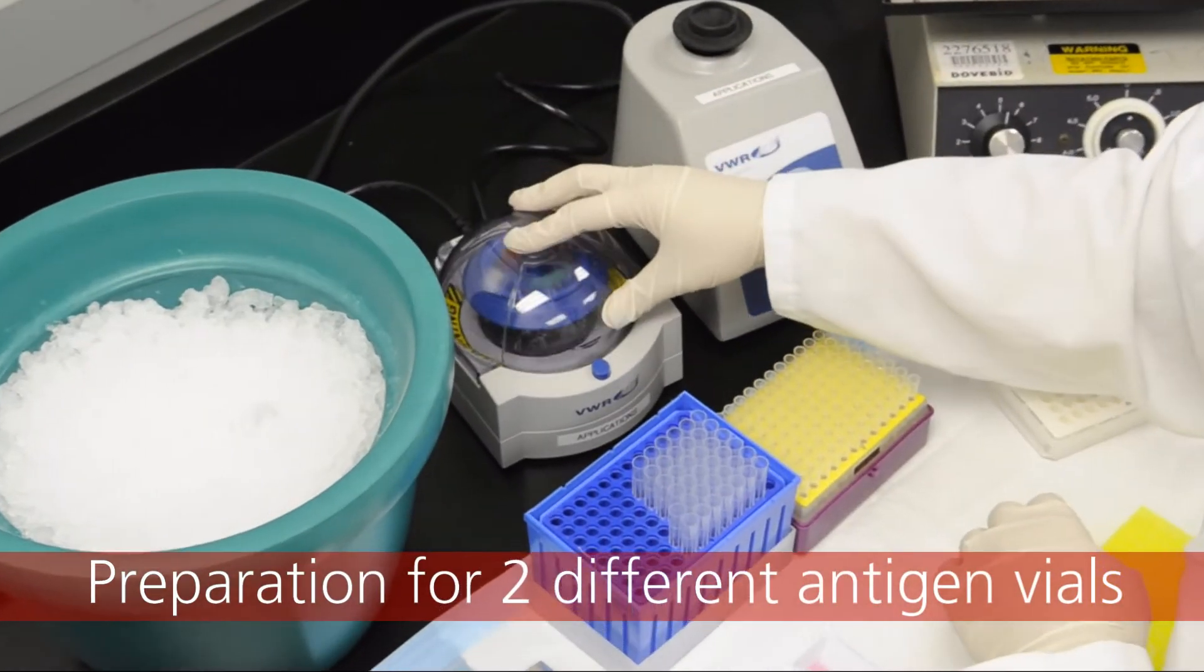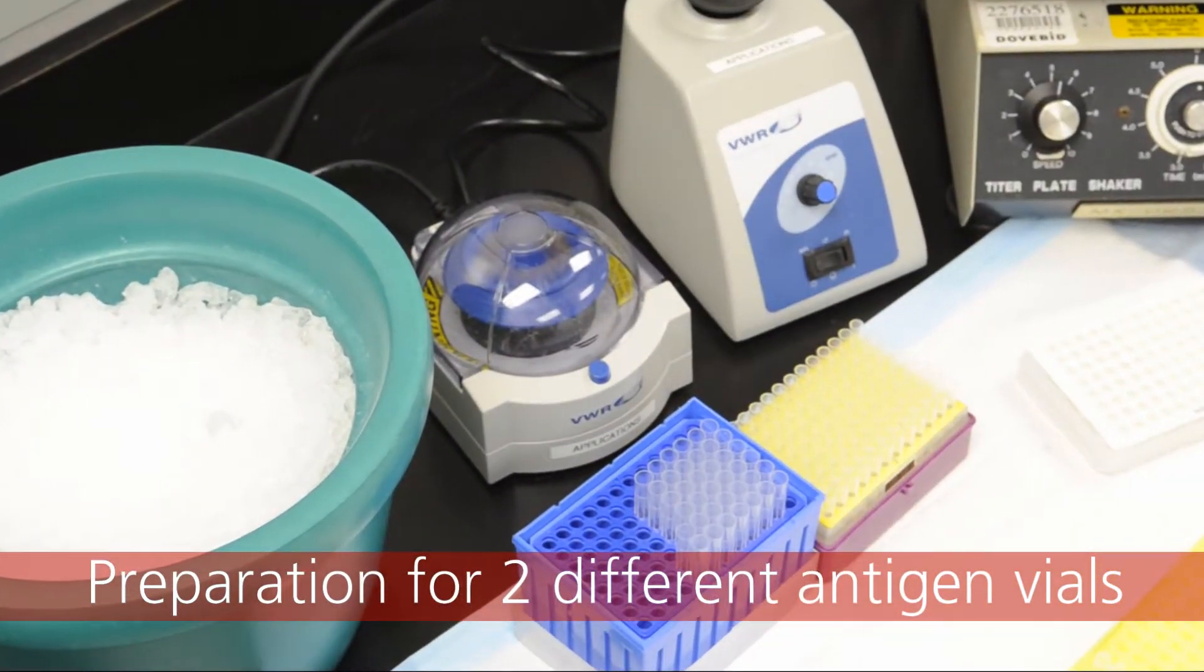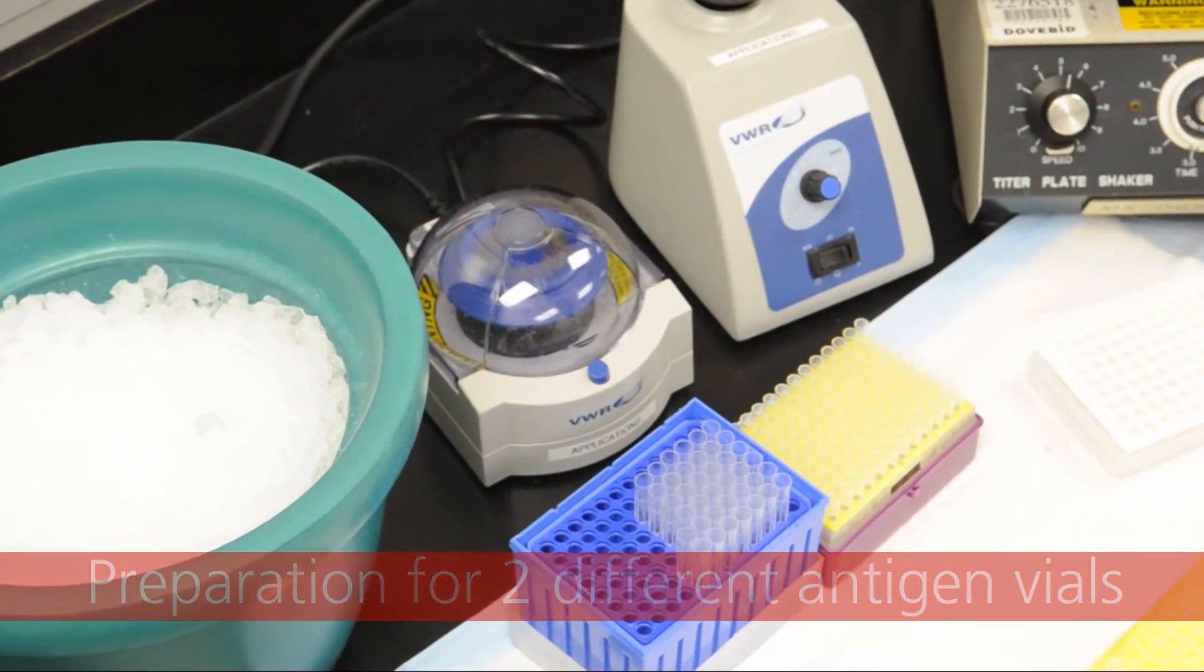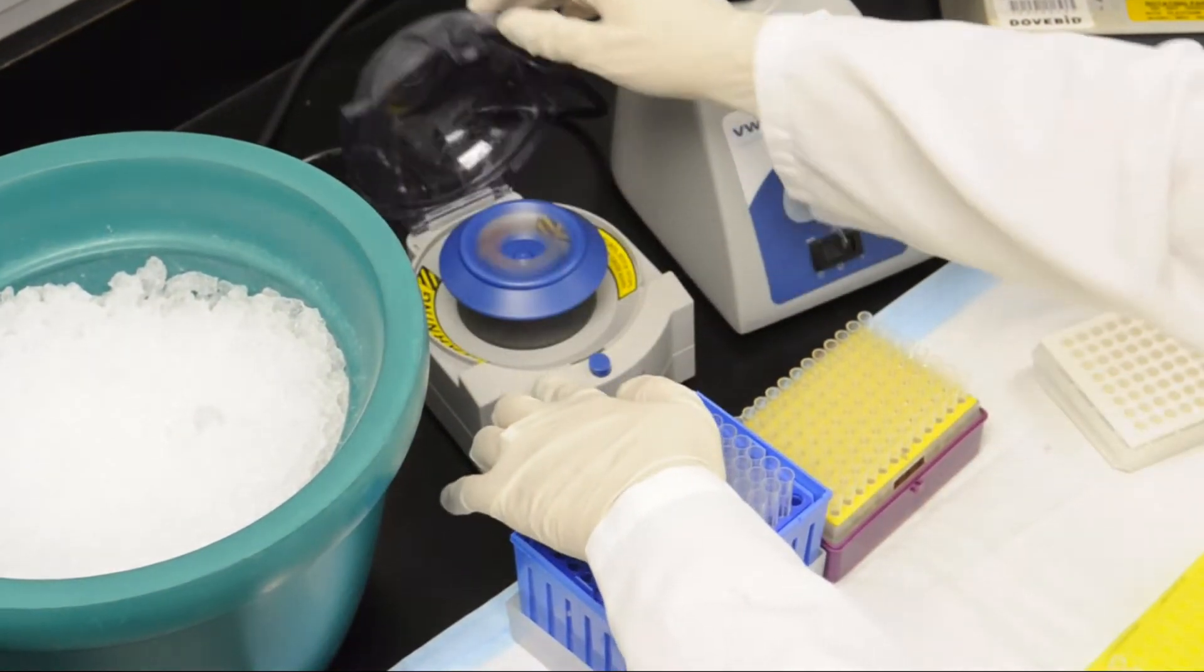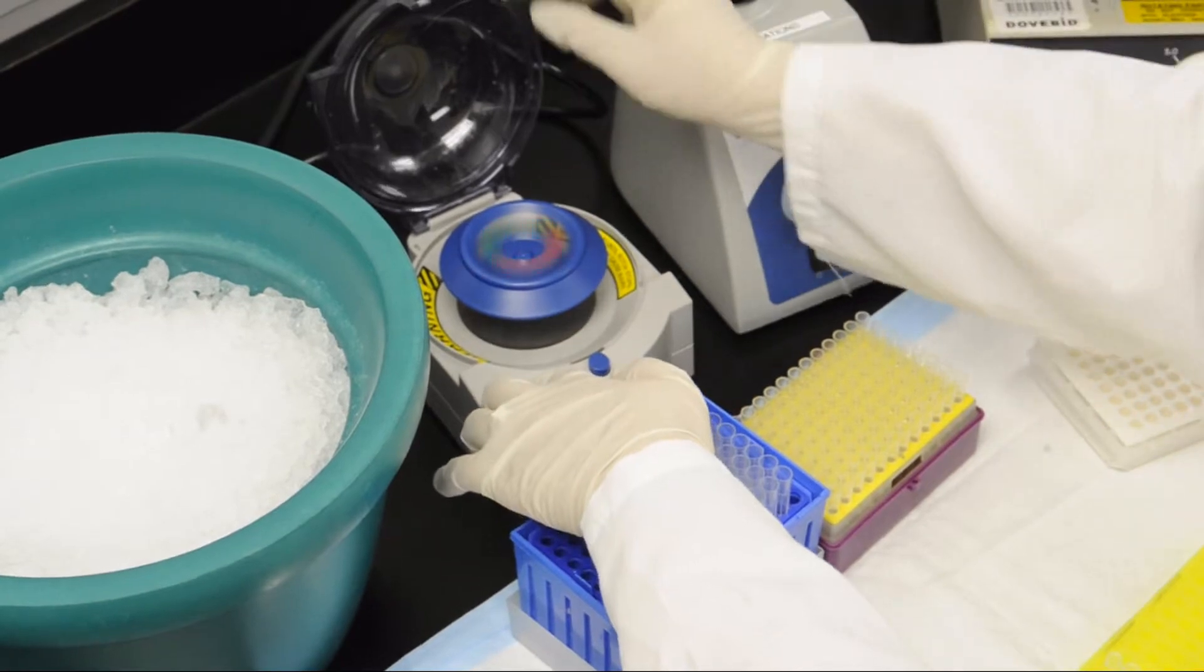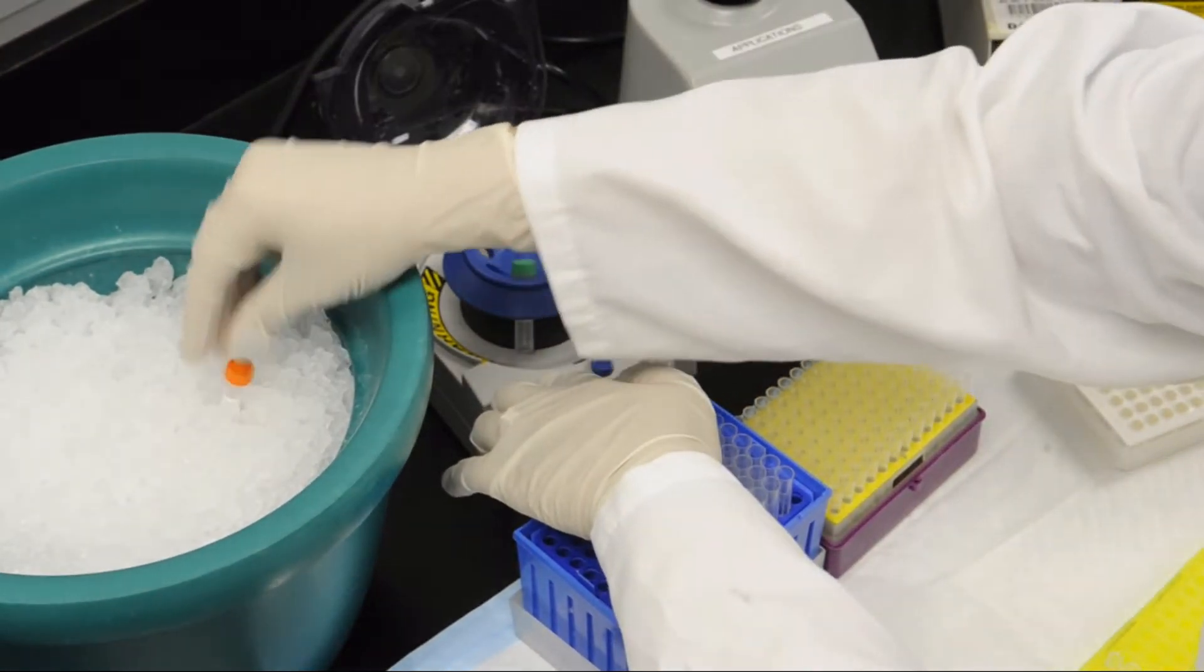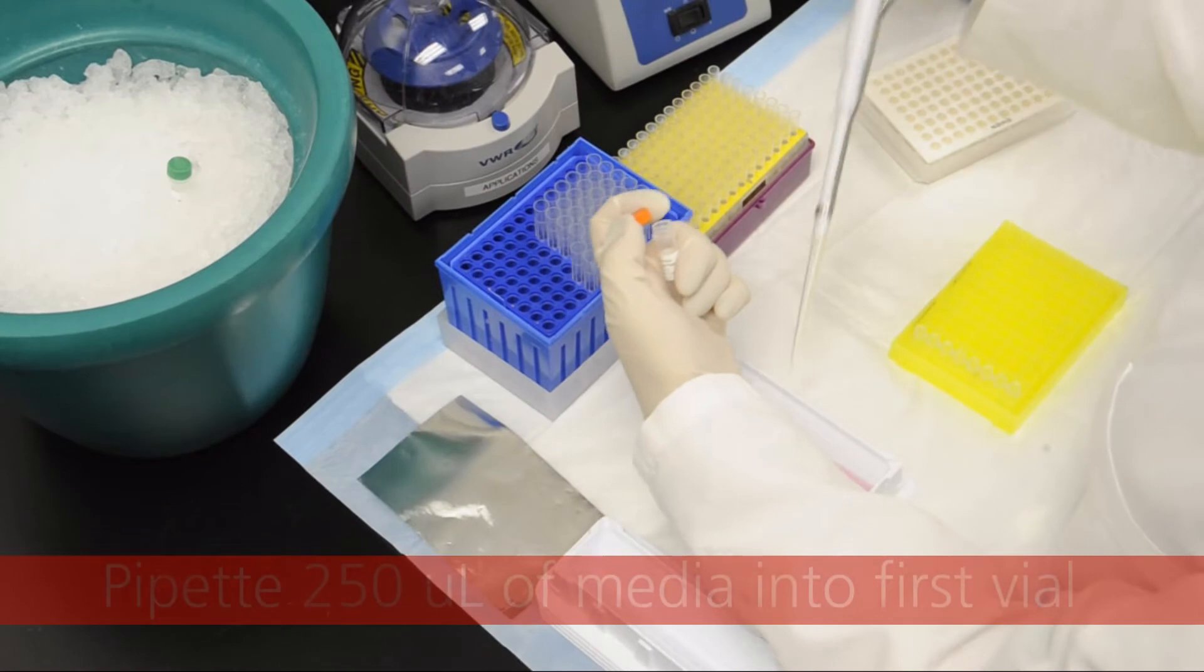This tutorial will demonstrate the preparation of the antigen standards from two different lots of premix antigen standards for use with cell culture supernatant samples. Quickly spin the two antigen tubes to centrifuge the lyophilized antigens to the bottom of the tubes.